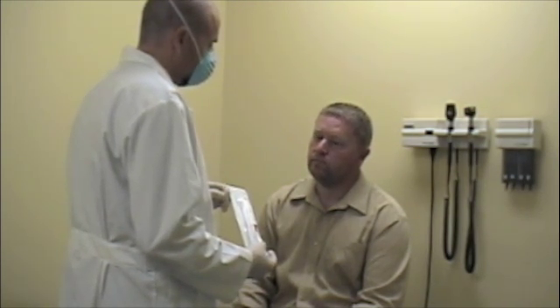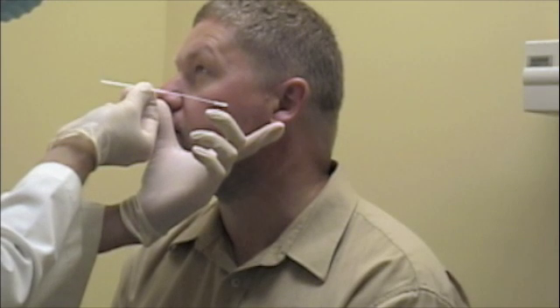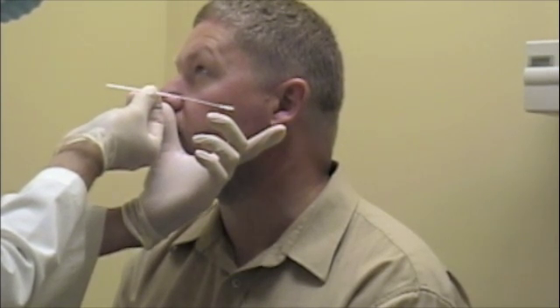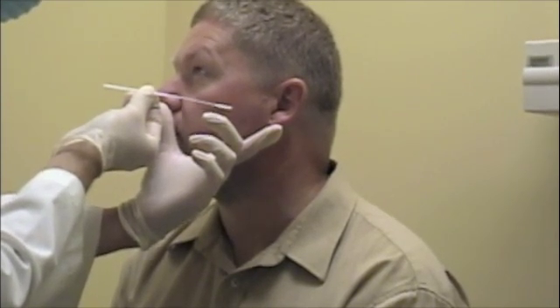Explain the procedure to the patient, telling them they may cough or their eyes may water. Ask about a deviated septum, and get the patient to gently remove excess mucus from their nose.